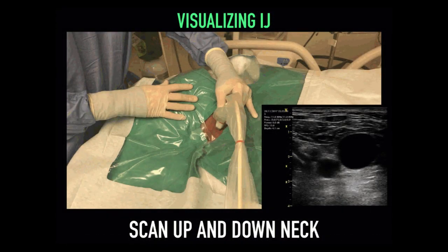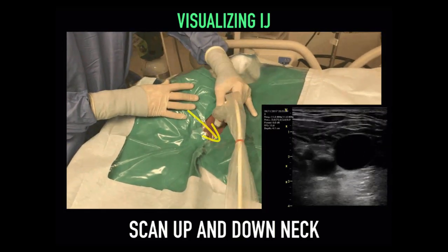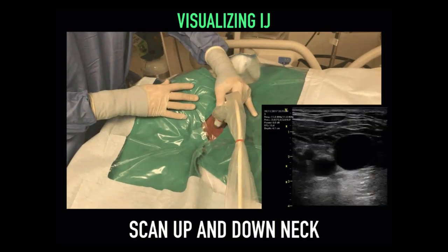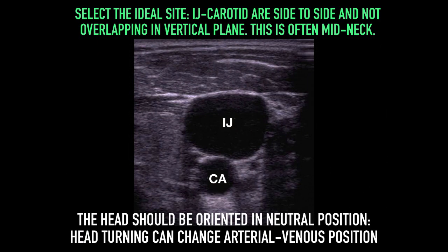You can also use ultrasound before your assessment to scan up and down the neck. This helps to give you a better understanding of the anatomy of the vasculature, but also any possible anatomical obstruction to performing the procedure. In selecting the ideal site, it is best for the vessels to be seen side by side.